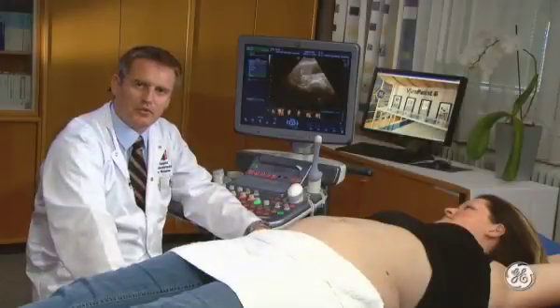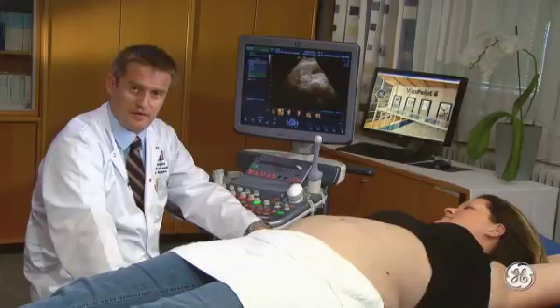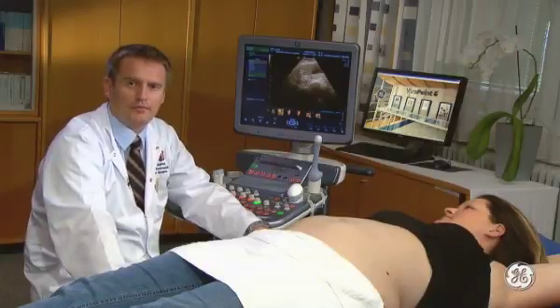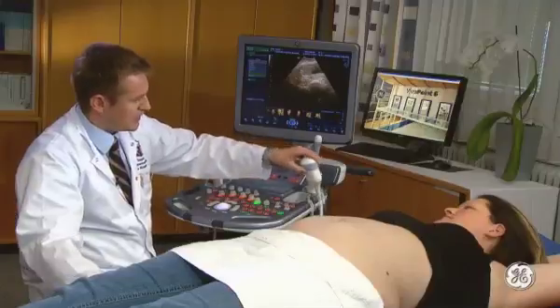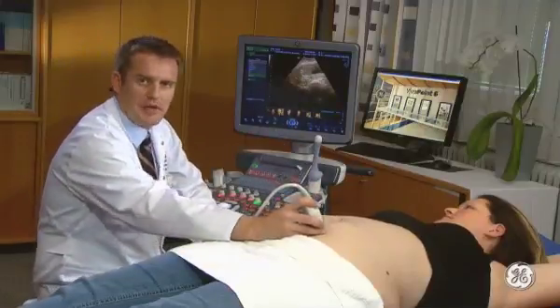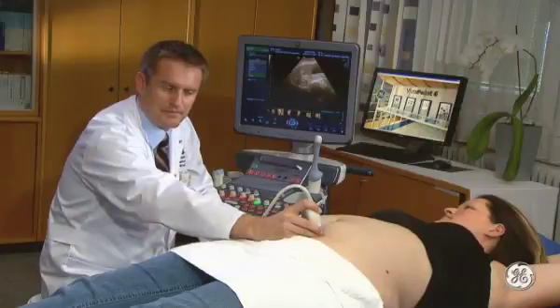In this part, we'll cover how to prepare 2D imaging as a base for 3D acquisition. First, let me explain the advantages of using a volume probe. From the appearance, it looks less handy, but in fact, its bigger size assures the proper stability of the probe on the patient's abdomen, which enhances the precision of our 2D scan.